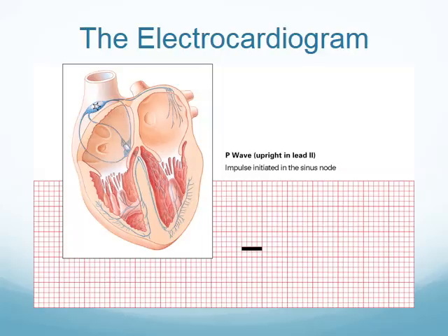So it's kind of in line with the direction of this general or average electrical direction or flow. So it's a very good monitoring lead because it shows us the best overall picture, and it kind of gives us the general look of things whenever we're monitoring a patient.